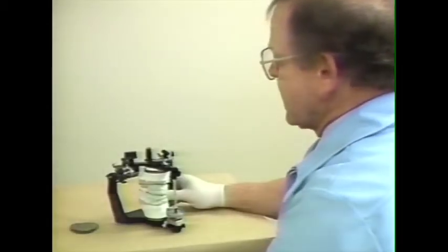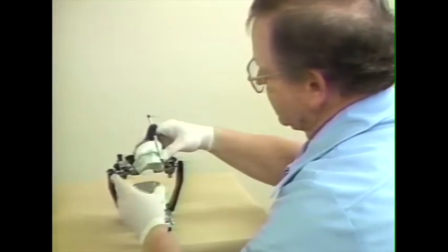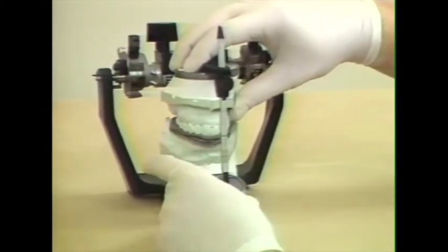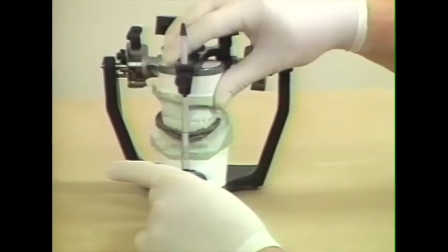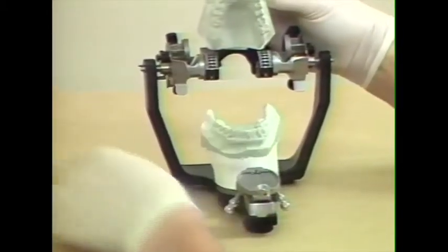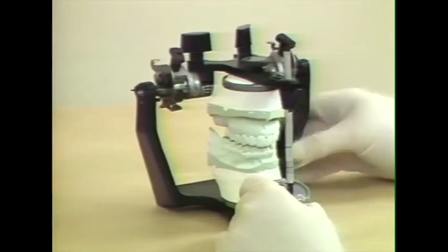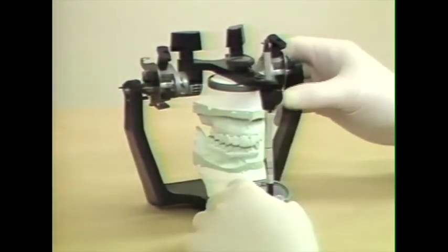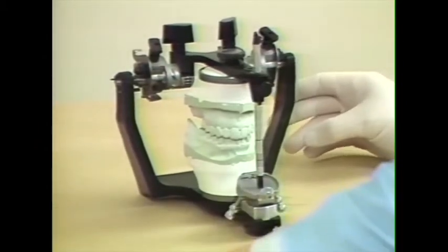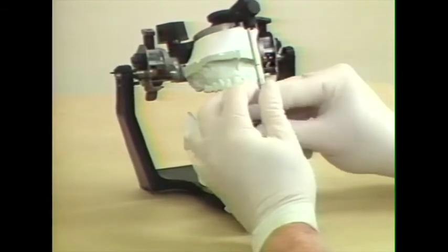We've now mounted the maxillary and mandibular casts. To mount the mandibular cast, we've used this centric relation record, and see it closes very nicely into this centric relation record. Now, to set the articulator according to the condylar registrations and the Bennett angle, we use the lateral check bites. And here we have the right lateral check bite.